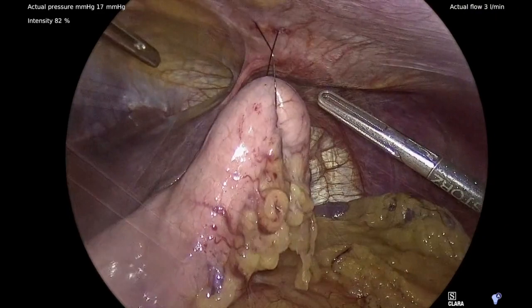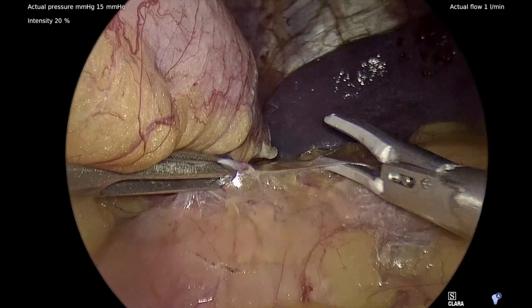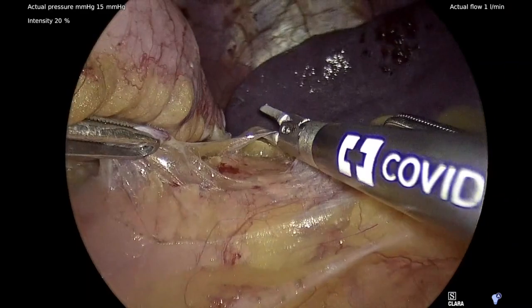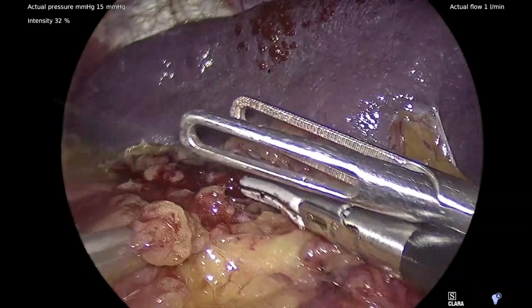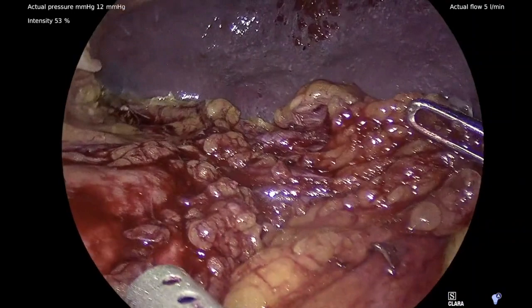Utilizing the bipolar shears, the peritoneum overlying the pancreas is opened to further facilitate the dissection. The curved tip of the bipolar shears allows for fine dissection within the distal aspect of the pancreas, thereby allowing us to expose several vessels within the distal aspect in close proximity to the spleen, including the splenic artery superiorly.